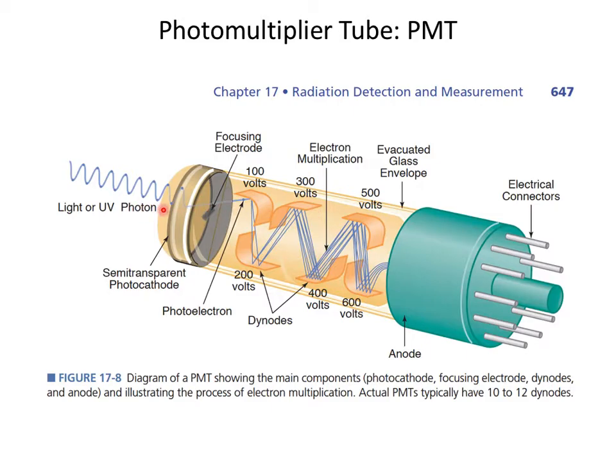non-digital technology, right? So you have these things here called dynodes, and there's a large voltage between this dynode here and the one at the back of the detector. As we climb along here, it's 600 volts. The whole thing can probably go to 1,000 volts. And between each one of these dynodes, you kind of focus. What happens is a light photon comes in here, creates an electron that gets ejected from this surface and hits this dynode, because there's a big voltage between the surface and the dynode. So all the electrons come up and hit it, right?